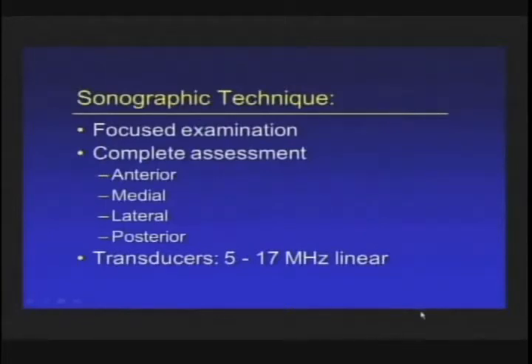And also the last point is you could have a referred pain. And so I approach an ultrasound like I do an MRI. If it says rule out Achilles tendon tear, I'm going to look at everything on every image. I'm not just looking at the Achilles. The same thing holds true with ultrasound.